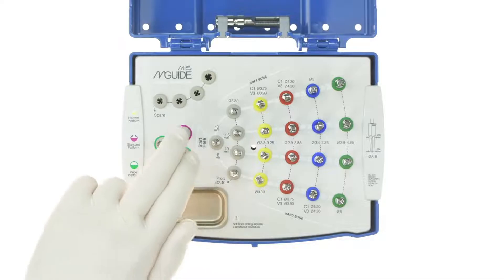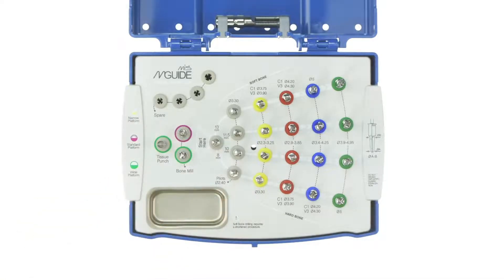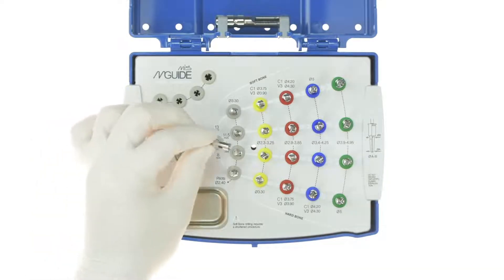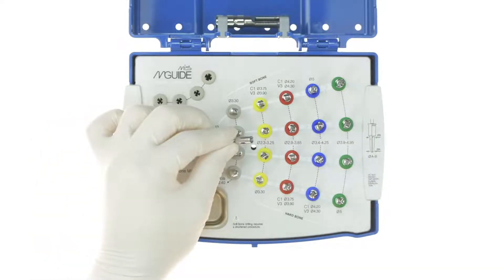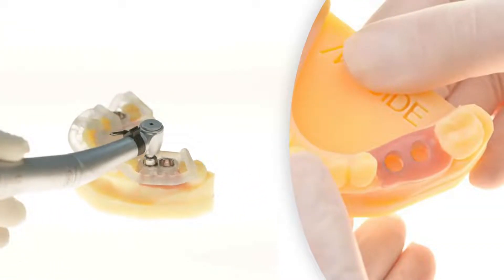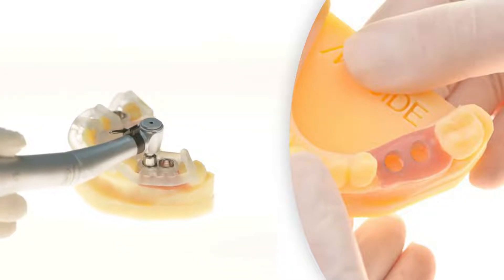The first tools used are to prepare the site for drilling. The first tool that may be used in a flapless procedure is the tissue punch. This tool creates a circular hole in the gingiva, which creates an access point for the drills that follow to go into the bone.